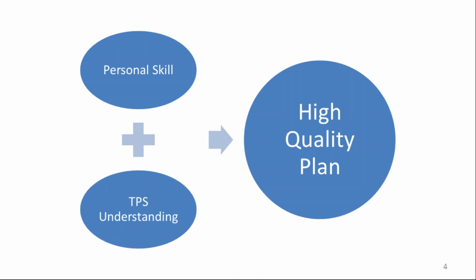In case we group these two things, the planner has very good skill as well as very good TPS understanding. If they were both together in a planner, surely the planner will have a high quality plan and will be able to generate a high quality plan in a timely fashion.